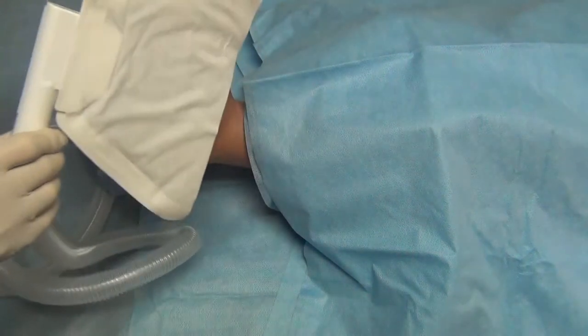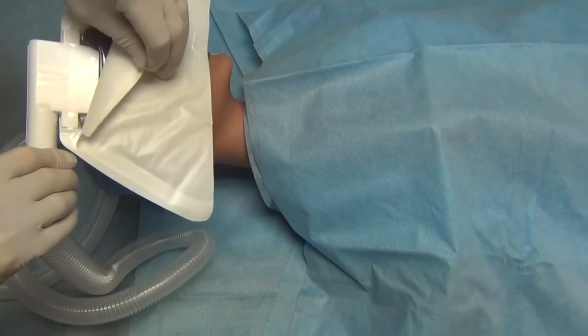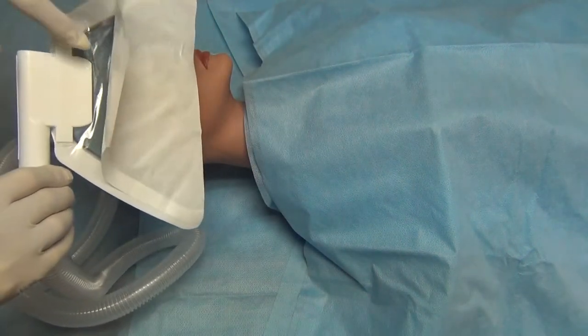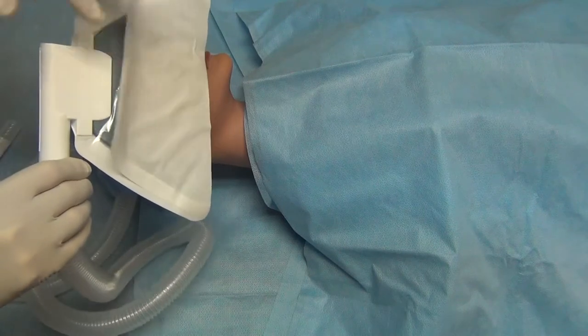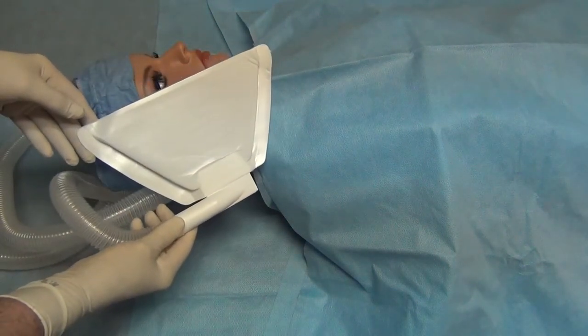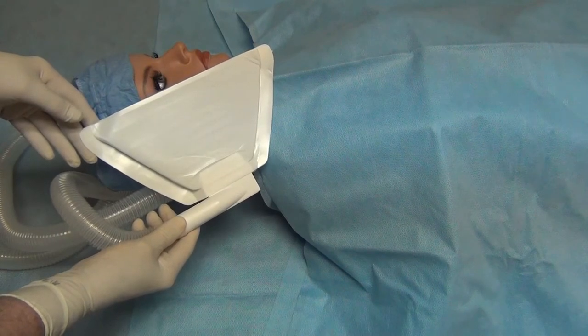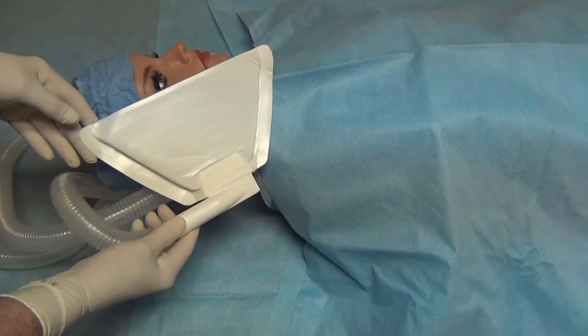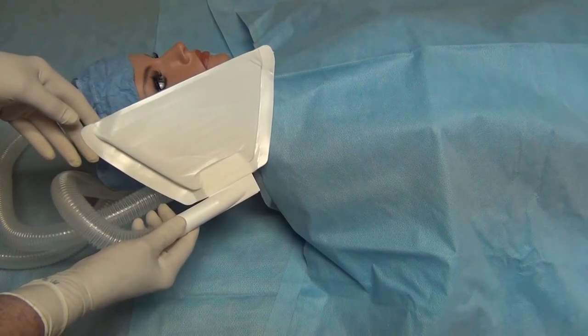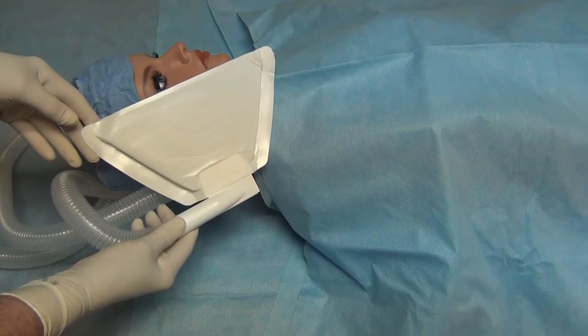The way to do this would be by removing the release paper with a very sticky edge, which you can then put directly on the patient's skin. I want you to understand that all these materials have been checked for skin sensitivity, hypersensitivity, and so forth.